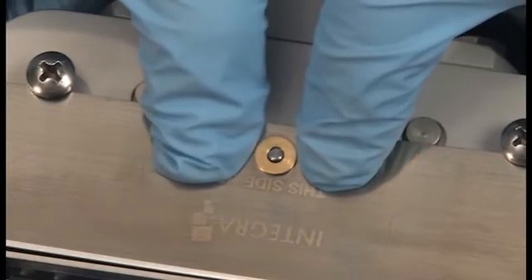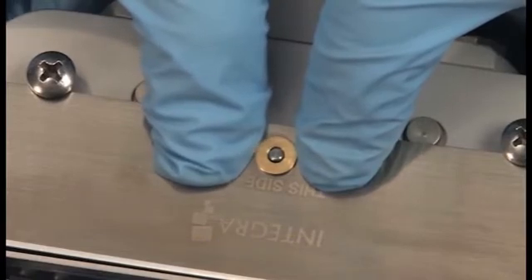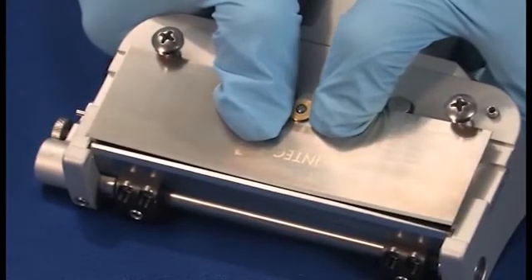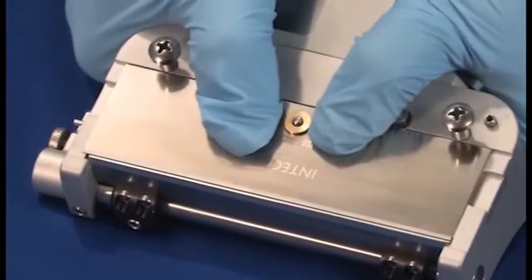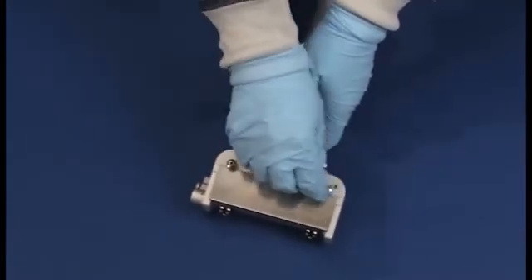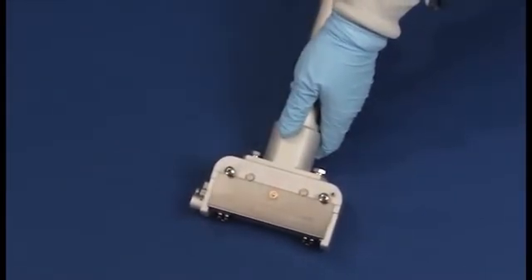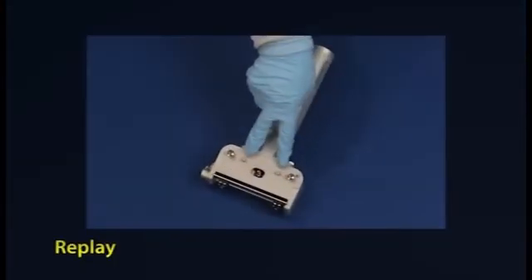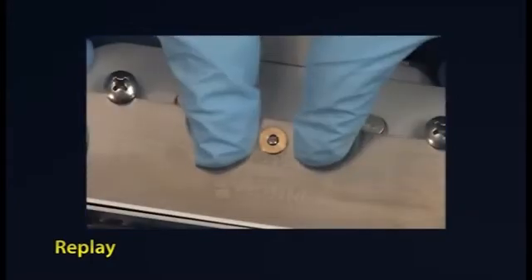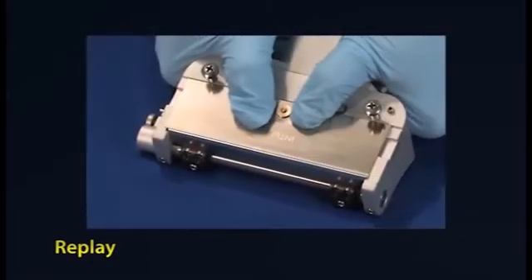Once you have the pin centered in the blade, continue pushing down to keep the pin centered. As you do this, push forward, allowing the blade to slide off the rear pegs and click into place. Once the blade clicks into place, apply a thin coat of mineral oil to the side that reads Integra. If at any point during the installation you are having difficulty, return to the starting position and begin again.